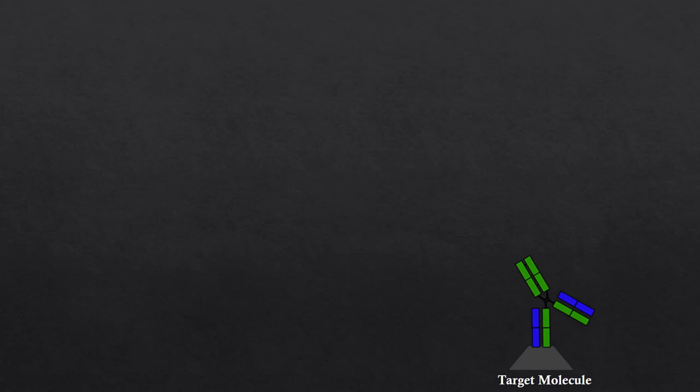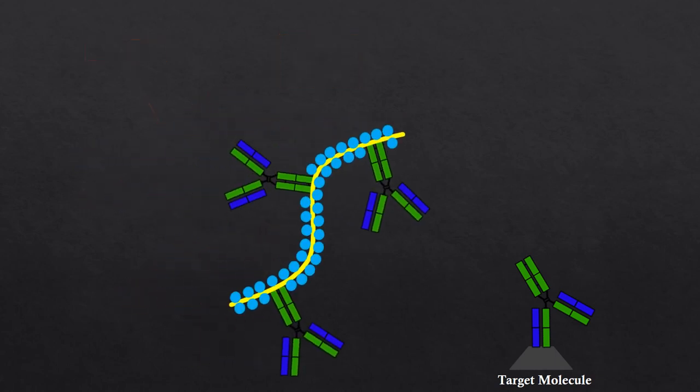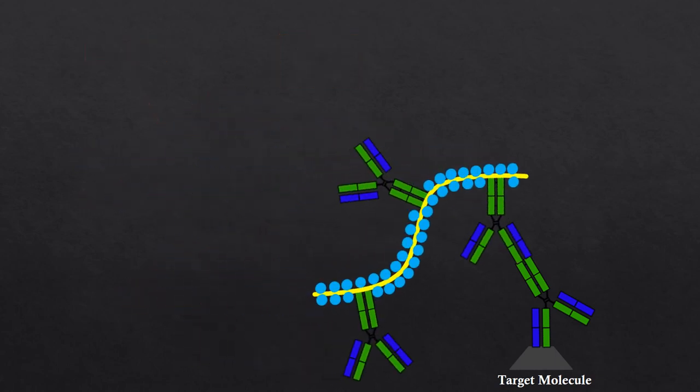Eventually, newer methods of finding the target molecule began taking hold. The polymer-based immunohistochemistry procedure has a pre-made complex with the secondary antibody. This reduces the number of steps required to attach a lattice of label molecules to the target molecule.